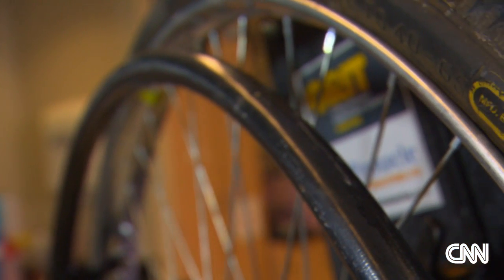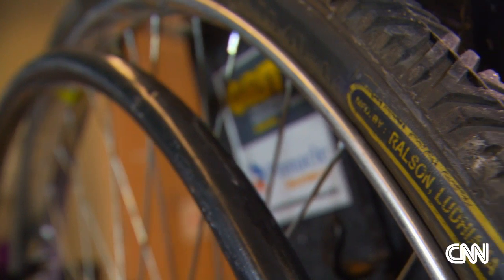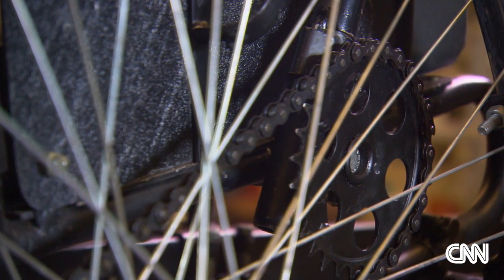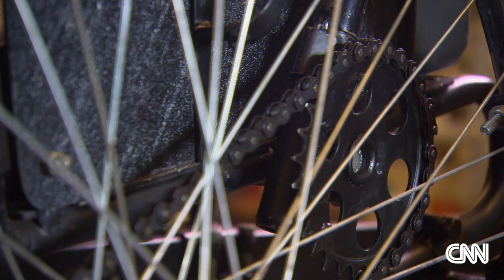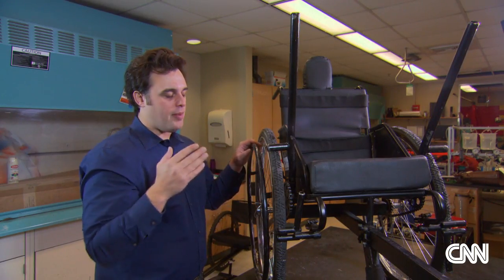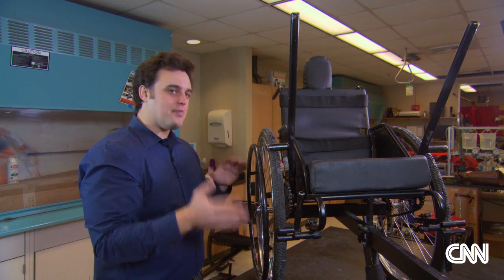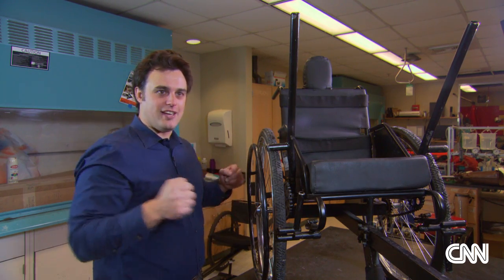And therein lies the genius. Even though the LFC technically has just one gear, it becomes, in essence, a three-speed chair, simply by having the user adjust the position of his hands. This chair can go about 80% faster than a normal wheelchair on the street, and produce 50% more peak pushing force.